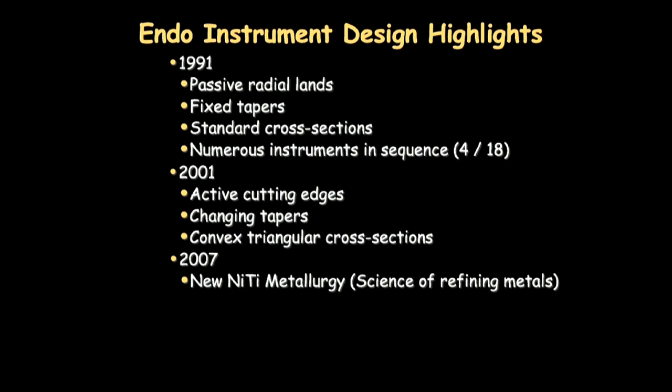And each file system, of which I thought there were 30, but someone recently said there are 80, so maybe there's 80, maybe there's 30. There's a heck of a lot of them. Each technology, each design has a sweet spot for the kind of metal that they use. And not everyone has discovered that for that metal, for their file, but that's ongoing research.